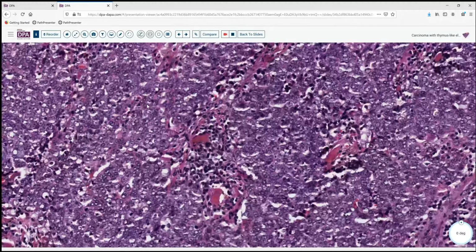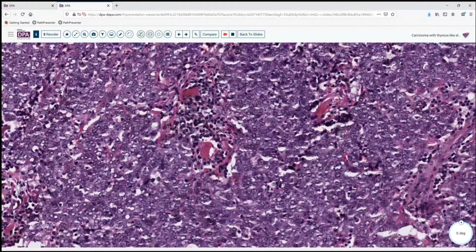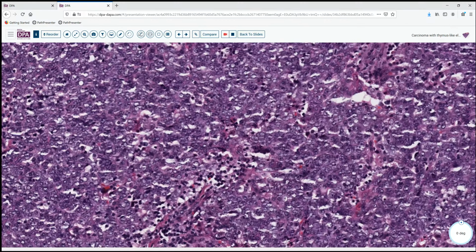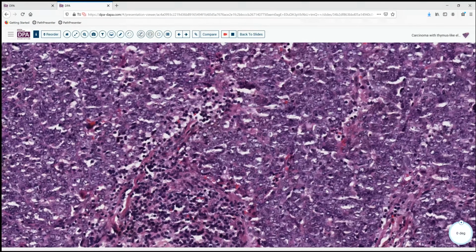And this lymphoid stroma and very poorly differentiated epithelioid appearing tissue raises the possibility of lymphoma, maybe of lymphoepithelial carcinoma or other related lesions. Maybe metastasis is a consideration. Melanoma, I suppose, could have a configuration somewhat like this, although usually more sharply defined.